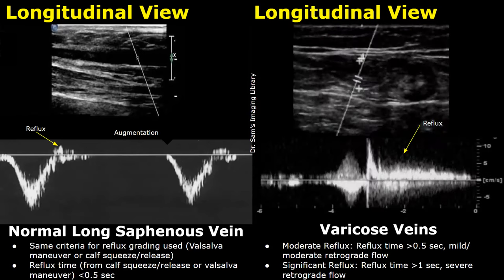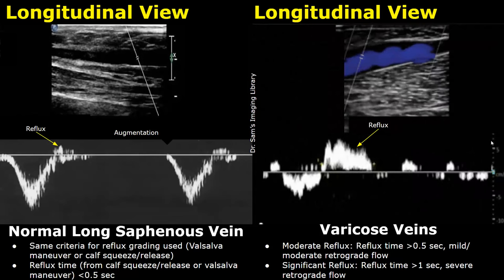Here is another image showing venous reflux in the long saphenous vein, in the setting of varicose veins. In this spectral waveform the reflux is more prominent. It is seen after calf squeeze and can also be seen after a Valsalva maneuver, and this duration can be calculated and the reflux can be graded.